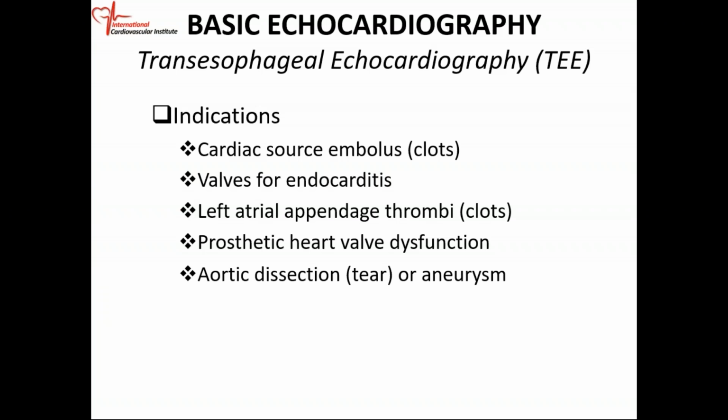And then again, sometimes you may see clots or tumors that you didn't expect to see. So if there's an embolic phenomenon, what we mean by that is a clot in an area that it shouldn't be. Well, the clot shouldn't be in any area. But if you think the clot is coming from the heart, then you can do your transesophageal echo and look at the heart.